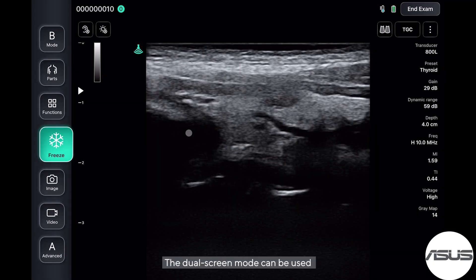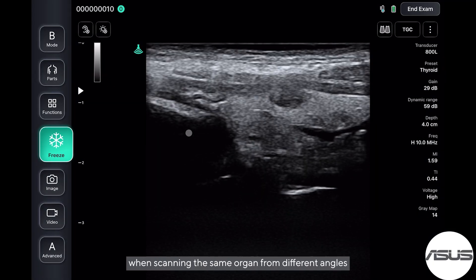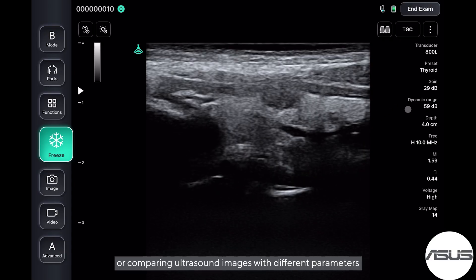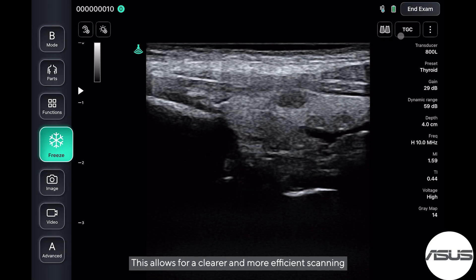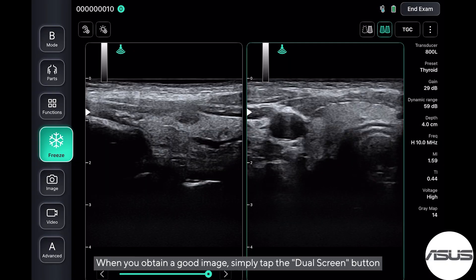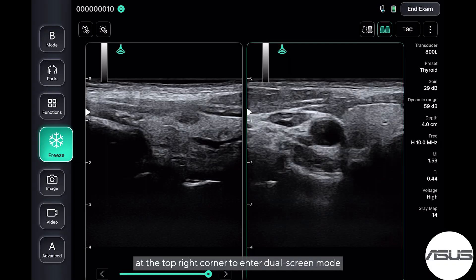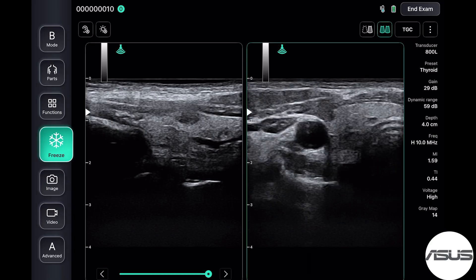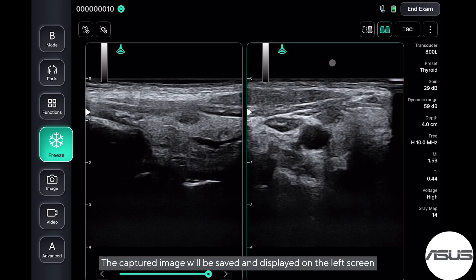The dual screen mode can be used when scanning the same organ from different angles or comparing ultrasound images with different parameters. This allows for clearer and more efficient scanning. When you obtain a good image, simply tap the dual screen button at the top right corner to enter dual screen mode. The captured image will be saved and displayed on the left screen.